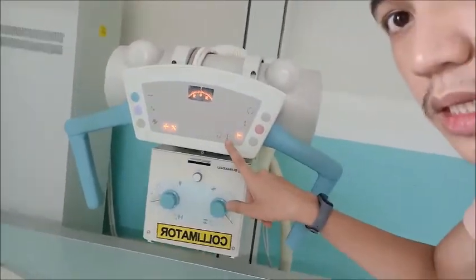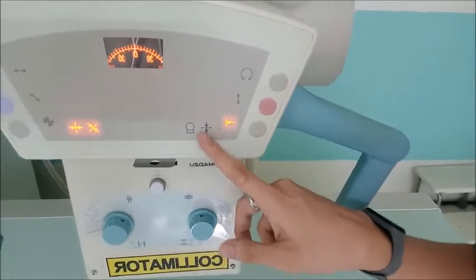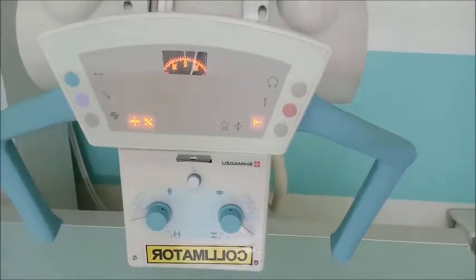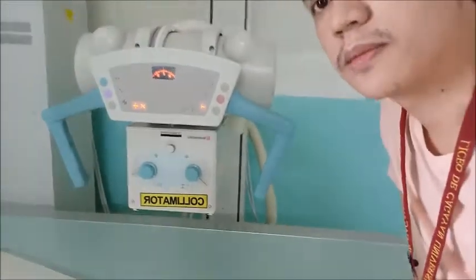That is for the 40. Okay? So this 72 SID is only used twice. One, very common, is the chest PA examination.